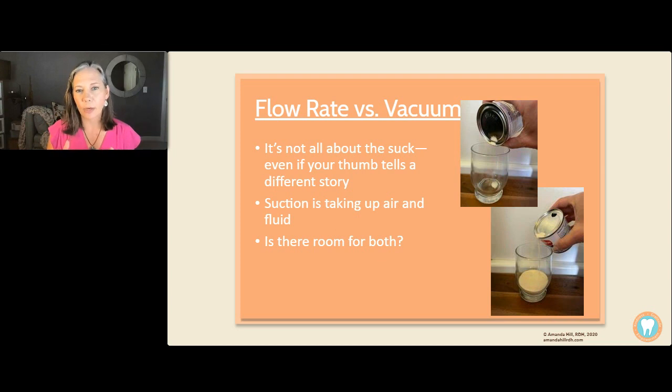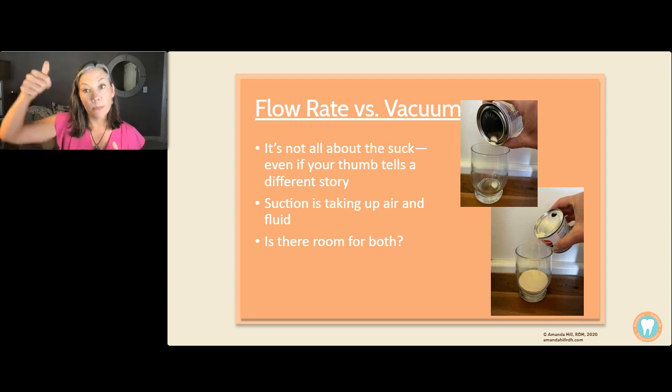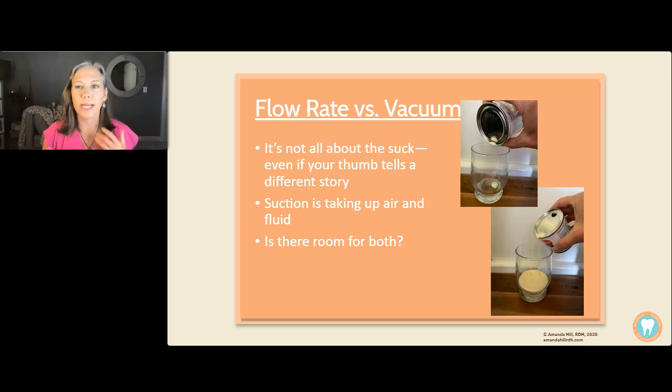I like to think about flow rate like a can of evaporated milk, and you can see these pictures here that I took. When you make one hole in your can of evaporated milk, it kind of drips out slowly, right? Because it has no airflow. But you pop that second hole in the top, and that air comes through, and it really lets that evaporated milk come out. When I explain this to my daughter, she's like, oh yeah, it's kind of like how you shotgun a beer. So evaporated milk, shotgunning a beer, whatever works in your brain, you need both, because we want to take care of liquids and we want to take care of aerosols at the same time. And is there room for both of those?